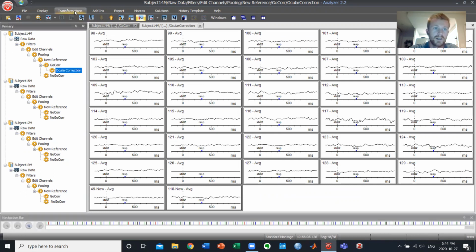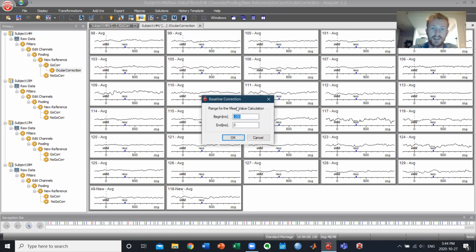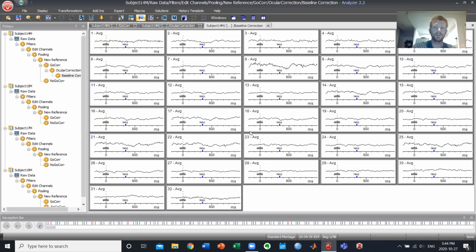So next, we're going to stay on this, and we're going to go to transformations and baseline correction. This step is really easy. We're going to use a 200 millisecond pre-stimulus period, similar to what we visualized here as our baseline. And this is for ERP analyses. If you wanted to do later on do time frequency analyses, you would have to move a little farther back. I think we recommend minus 500 to minus 300 milliseconds.